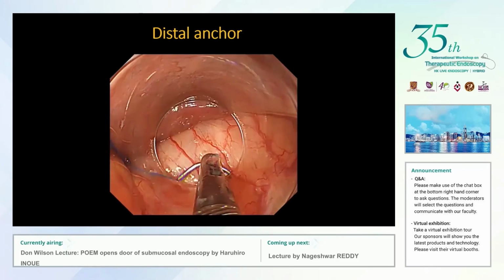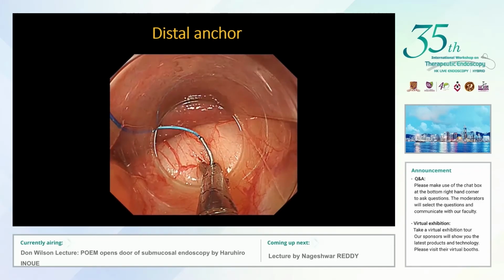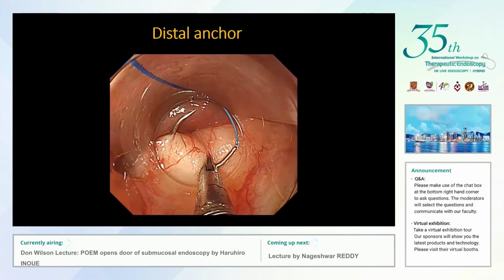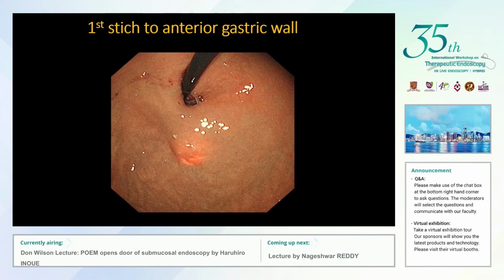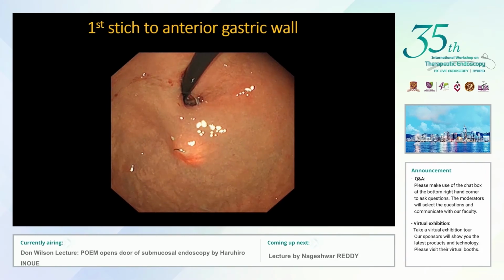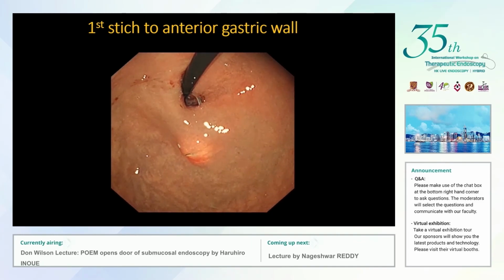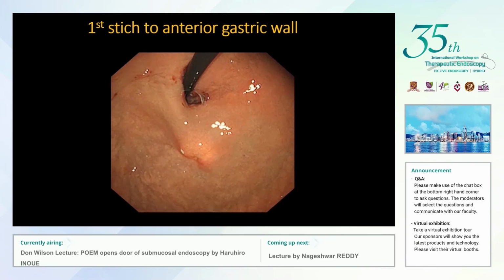We are placing the transmural suture, this way. So the needle is coming back and then out. Okay. So at this moment we control the gastric gas using the second scope. You can see our needle passing into the intragastric lumen, and then the needle is out.